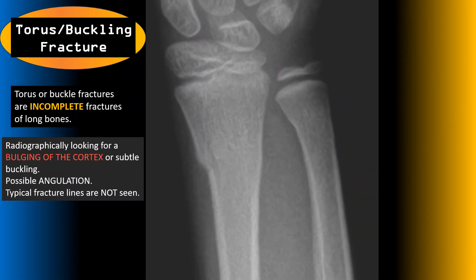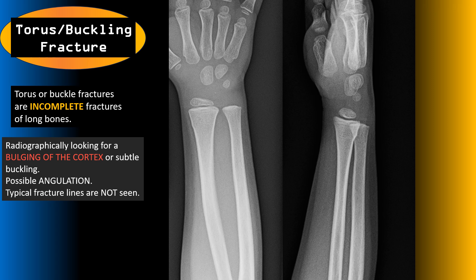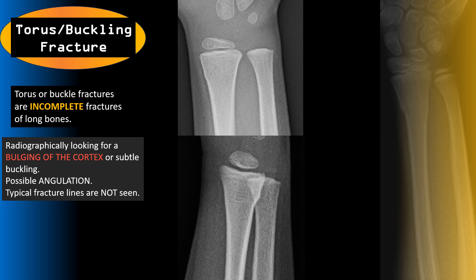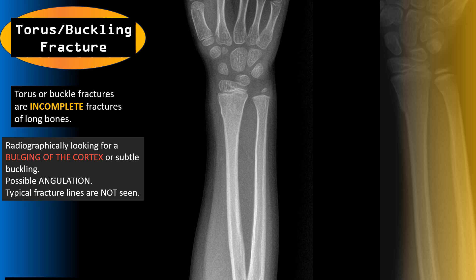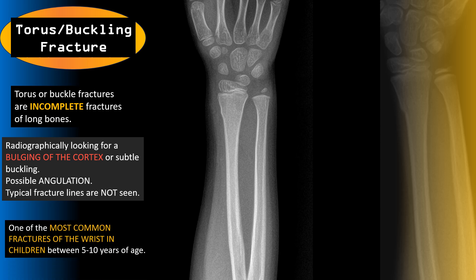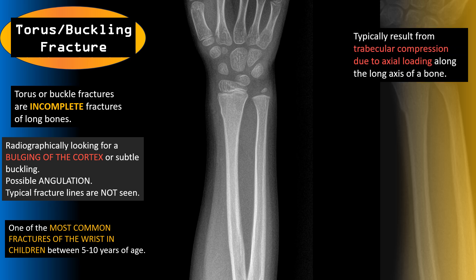A torus or buckling fracture is an incomplete fracture of a long bone, and these can be really difficult to see because there's no true fracture line visible. Instead, what we're looking for is a bulging or subtle buckling of the cortex. When we zoom in close you'll see two small bumps and cortical irregularities representing the buckling fracture. These are one of the most common fractures of the wrist in children between five and ten years of age.